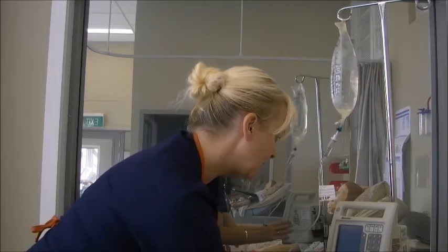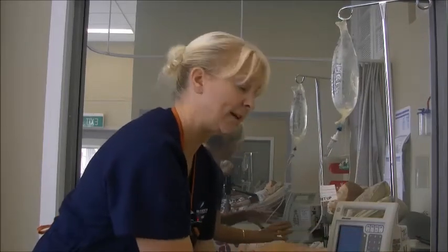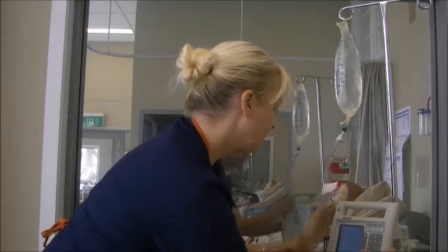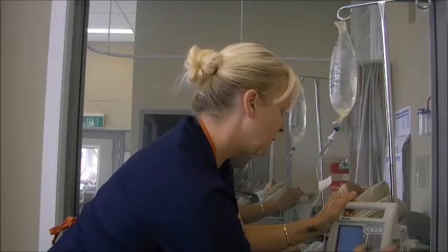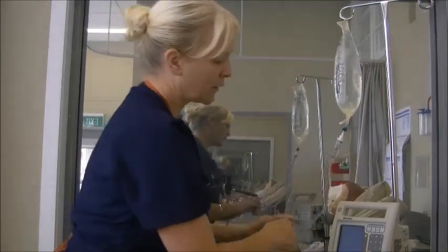And you go yes, and then it's going to give you new patient. I'm going to push new patient, and it tells me that the memory has been cleared. So I know that the information I'm going to put in now is the current for my patient. So I press done. What I then need to do is I've calculated 125 mils per hour, so I'm going to put in the rate, which is 125, the volume, which is 1000, and then I'm going to press open.